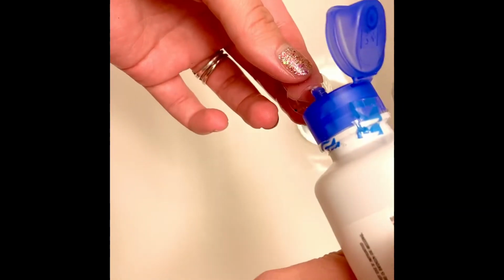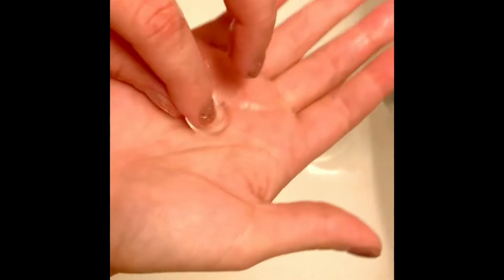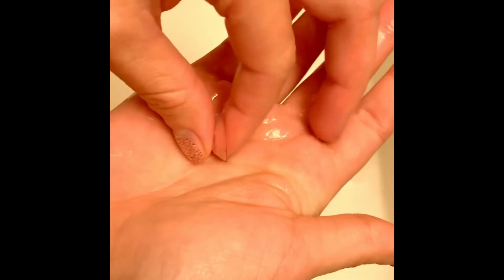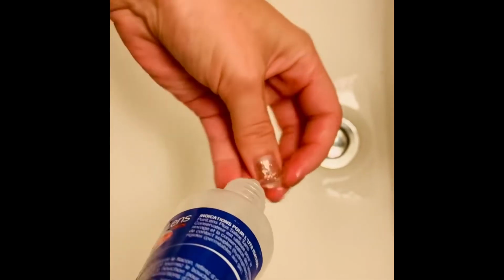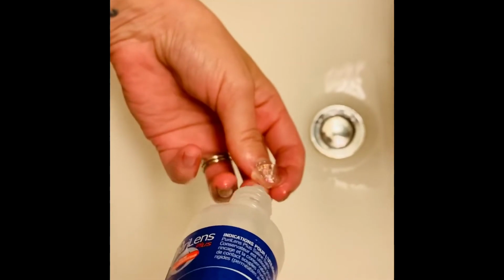I always like to start by disinfecting the lens. And I use this. Of course it sat in that overnight, so this just helps get any extra protein off that would make my vision blurry. I just rub it around a little bit until I feel that's good. And then I use my saline solution to clean off the cleaner I put on it, because it can make it kind of blurry, and it'll get off any of the extra protein that was sitting on my lens.